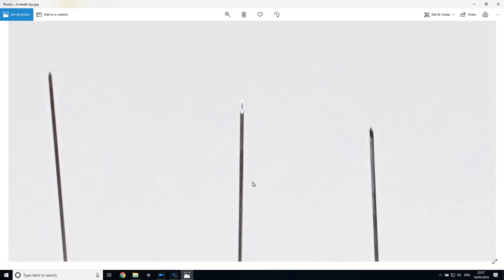So that might also explain why there are differences in insertion between these three different needles, both in terms of the actual tip itself, its tip shape, but also in terms of what might be going on along the shaft of the needle in terms of any potential coatings that might be there.